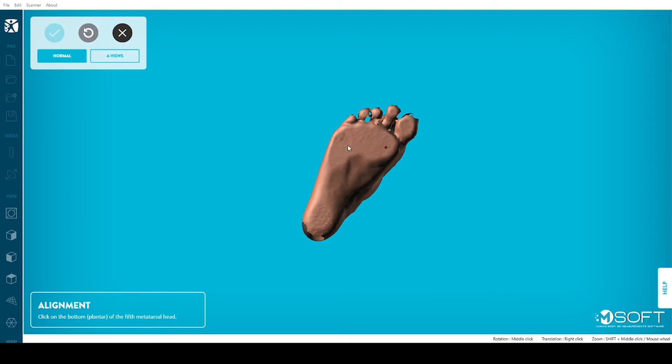Click to identify the bottom of the first metatarsal head, then the fifth metatarsal head, and finally the bottom of the heel. Respecting this order is essential.